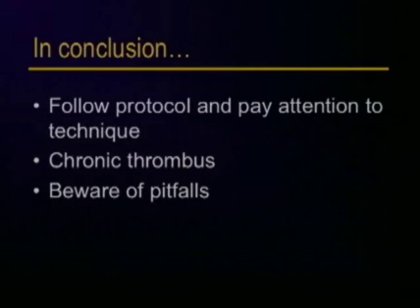I'm going to start with a summary of this talk. First, you want to follow protocol when doing this examination and pay careful attention to technique. The second part is about interpretation, and I want to point out that the phrase chronic thrombus is something that we don't want to use. We might want to say chronic changes or sequelae of prior thrombosis. And the third, it is important to know certain pitfalls that you may face in order to avoid making a misdiagnosis.